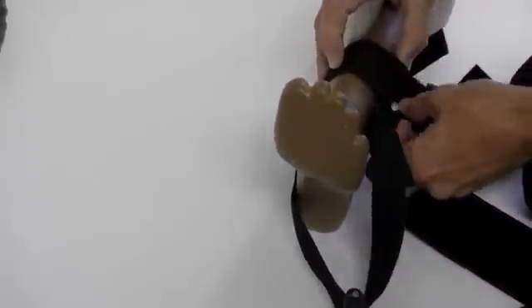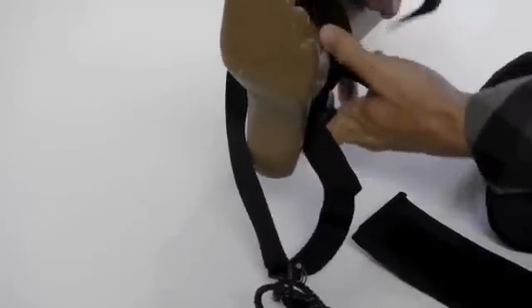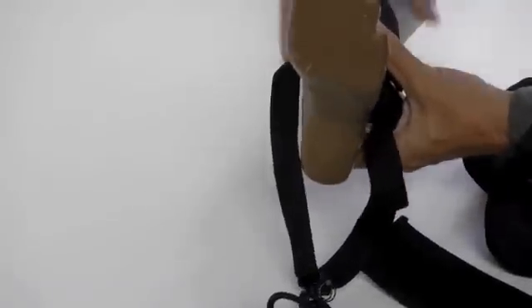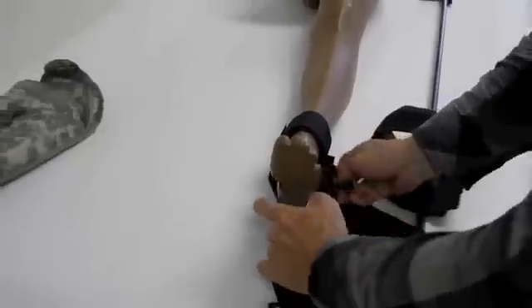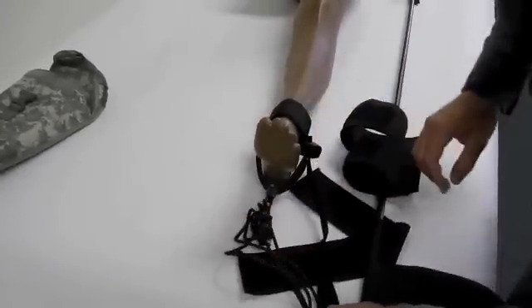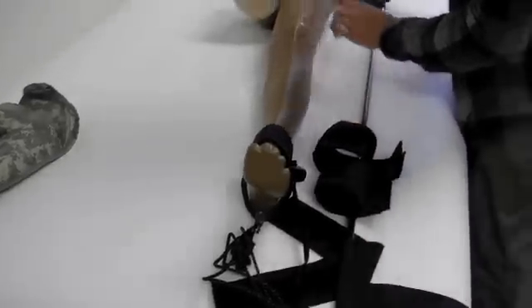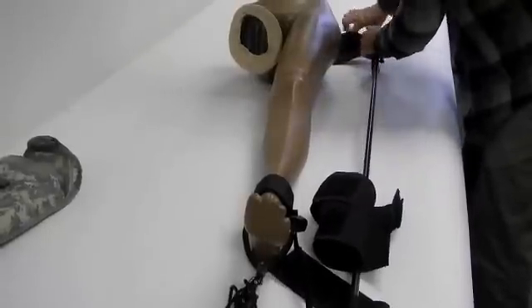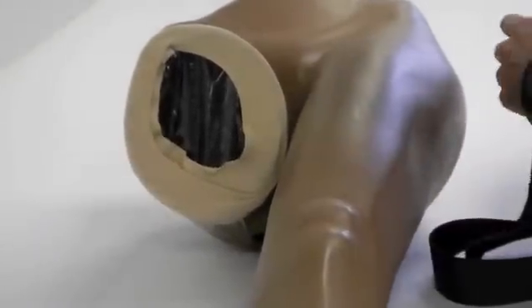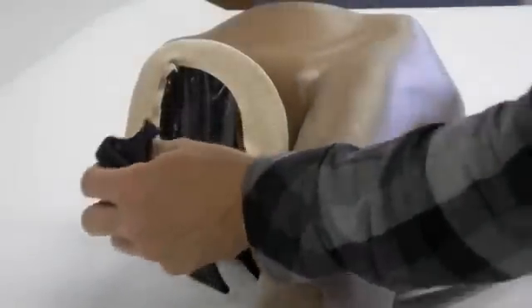We'll go ahead and wrap the strap around here. Tighten up the strap below the patient's foot like so. Tighten up the strap. Now we're going to go up to the ischial strap. Tighten up the leg.